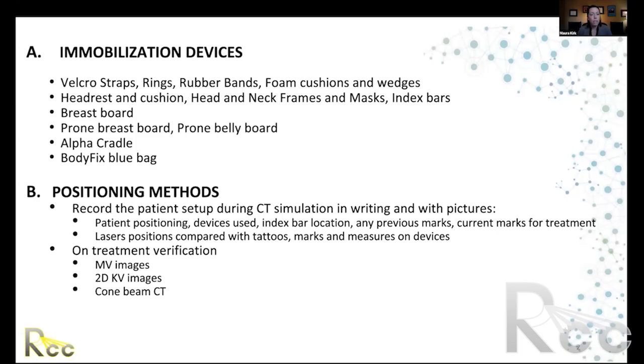We'll look at some breastboard options, a prone breastboard, prone belly board, and then different types of body fixation that can be molded to the specific patient, like an alpha cradle or a body fix blue bag.